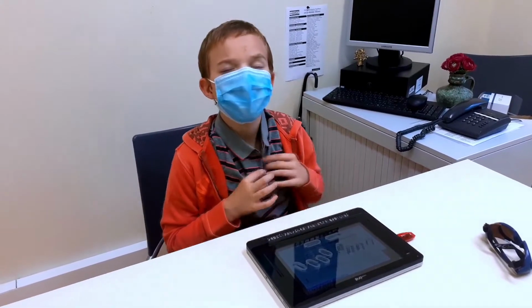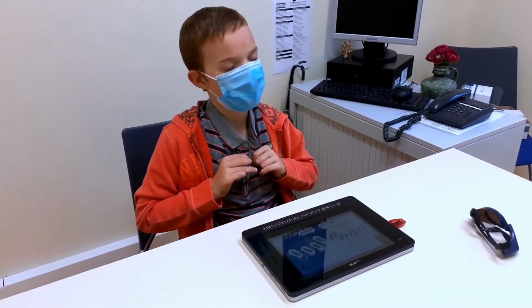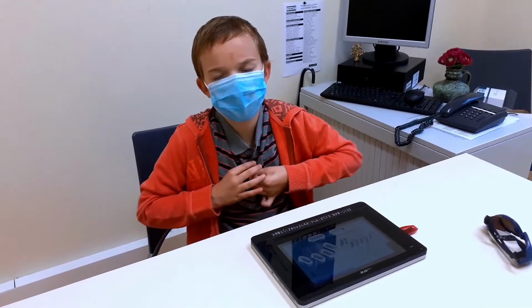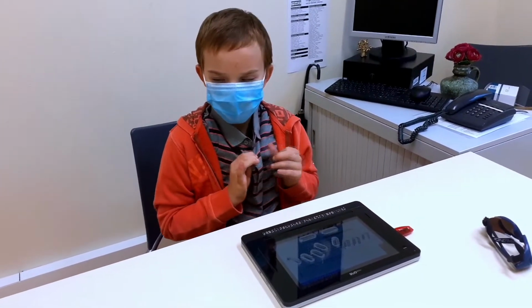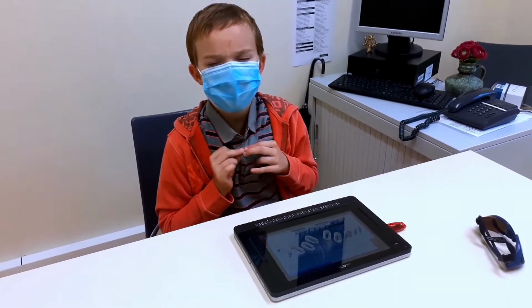I have a USB stick or thumb drive, and they save it in a format. Then I can import it in .note format from any format. I can save it in .note. Which other formats can you use? I can save documents in formats like Word, text, PDF, DocX, ODT, RTF, and TXT.